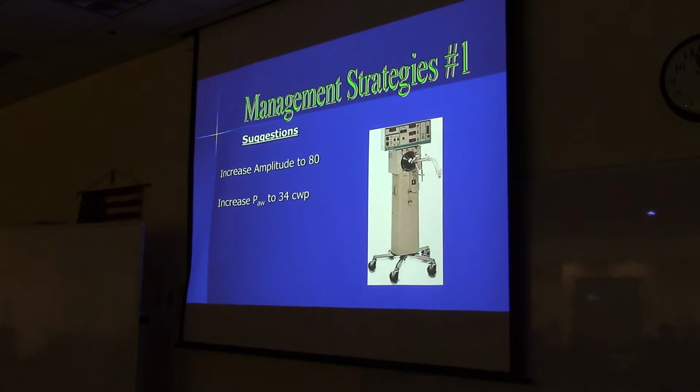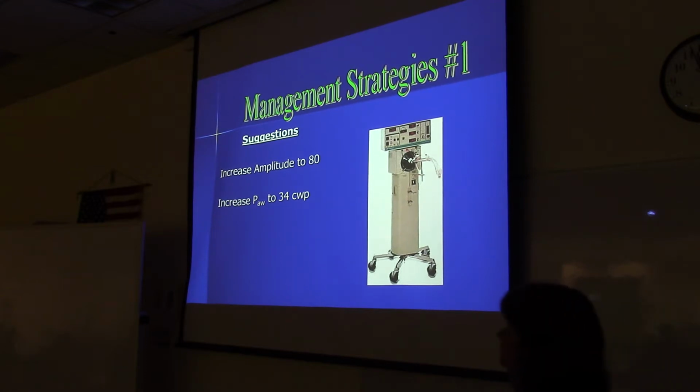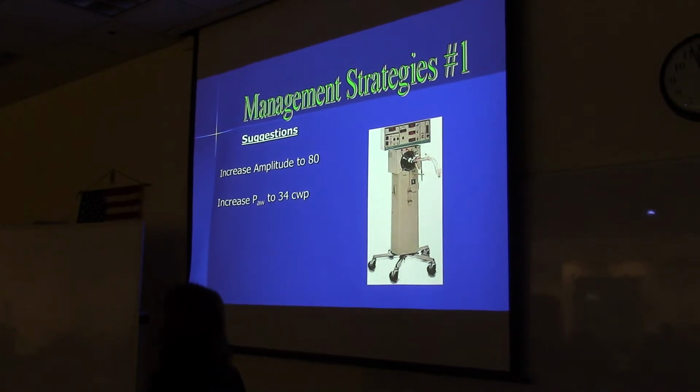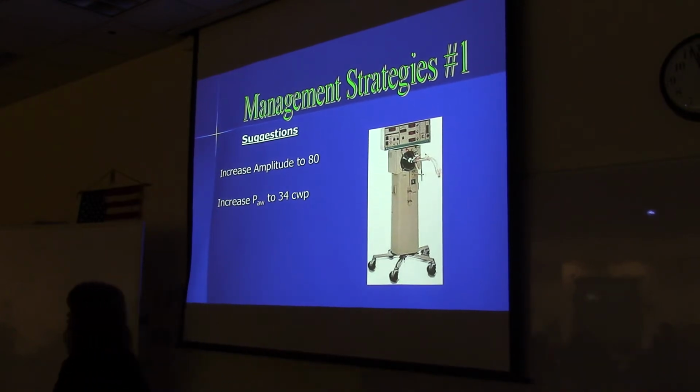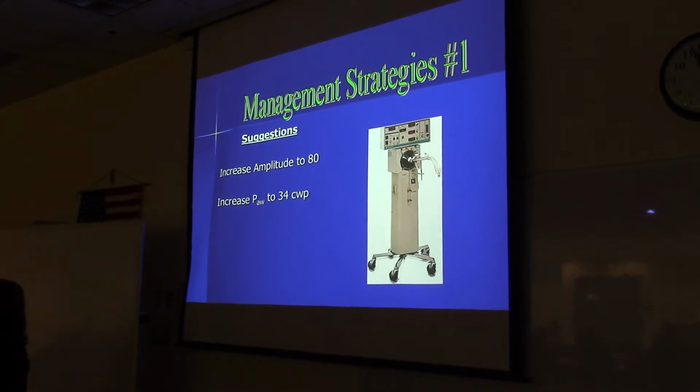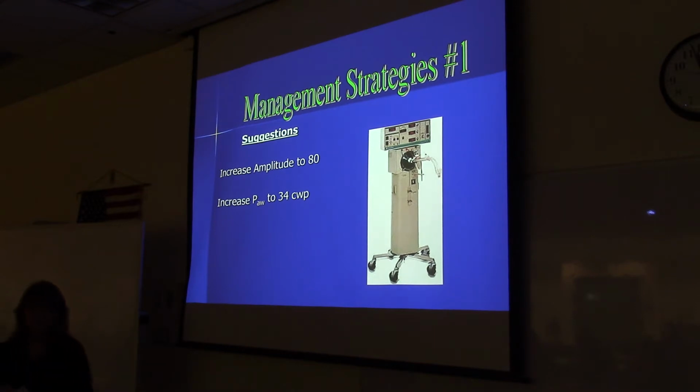I have a question. Okay. With the power setting, how does that help with the amplitude? Do you have to change the power setting to actually increase the amplitude? Yes. You don't have an amplitude knob to increase amplitude. What you have is a power setting for the piston. So the more power to the piston, the greater the amplitude. Good questions.